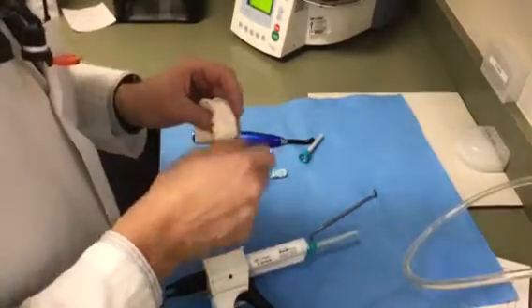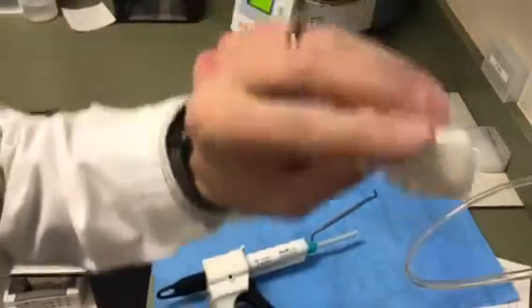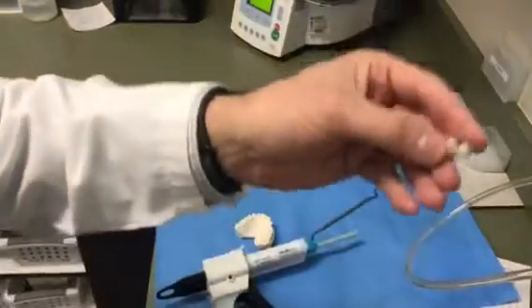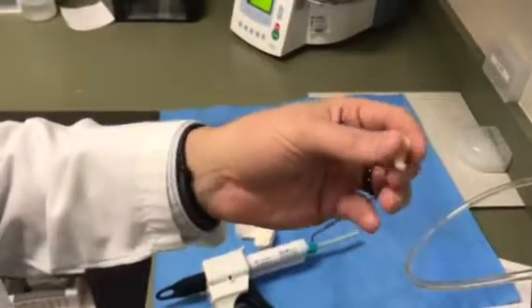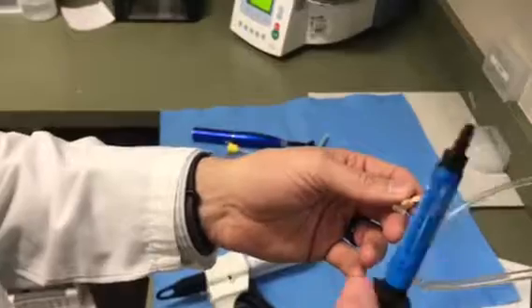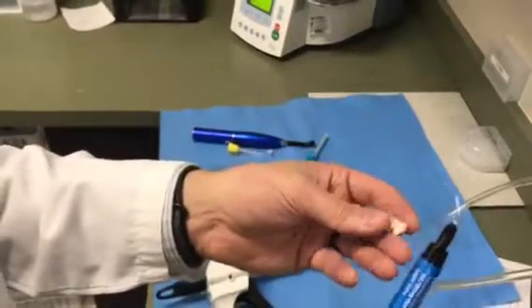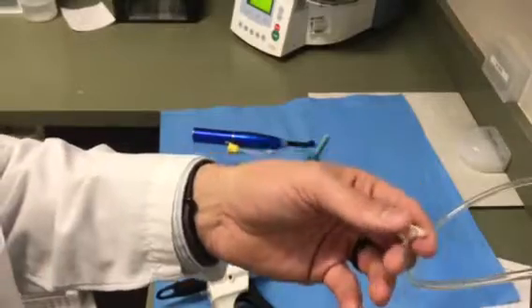So now, instead of being the model, let's pretend this is the patient's mouth. One of the most accurate methods that you'll have is to actually go ahead and recontour it yourself until it's perfect. The way you do that is I usually just use liquid dam. I use it because it's blue. This stuff doesn't handle that well, and so it ends up being just a little bit rough. So usually I tell the lab, hey, replace the blue with your own, but make it a little bit smoother, because it's not that smooth.